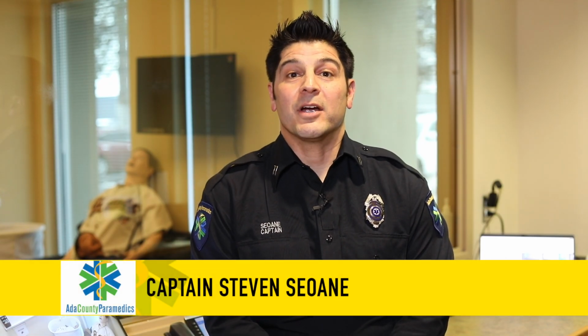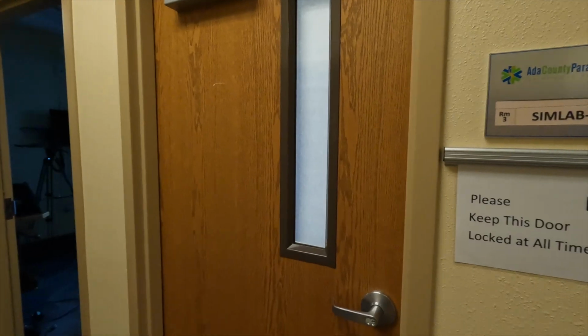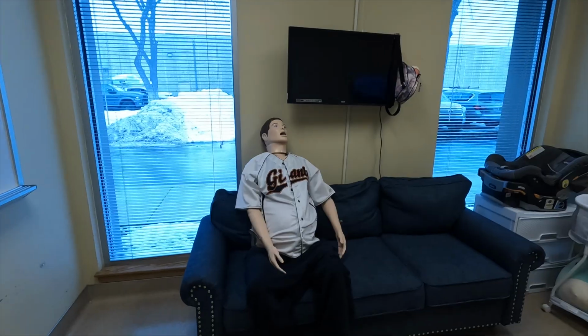Whether you are here preparing for Phase 4 testing with the medical director or going through practical testing as a potential new hire, we would like to introduce you to the rest of the Sim family. Starting with SimMom, let's review some of the cool new features.